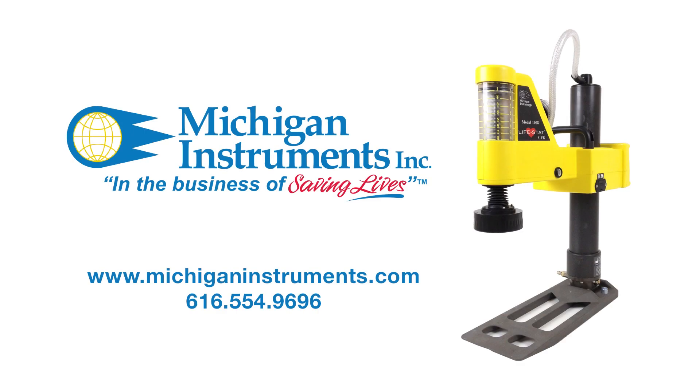The Life-Stat by Michigan Instruments. Rugged, reliable, and ready to go.